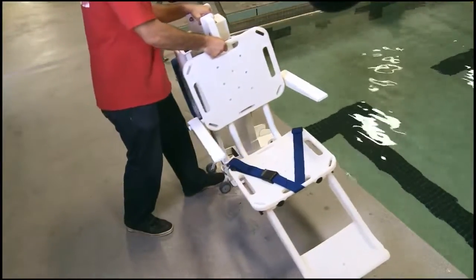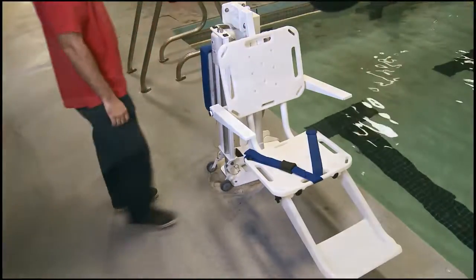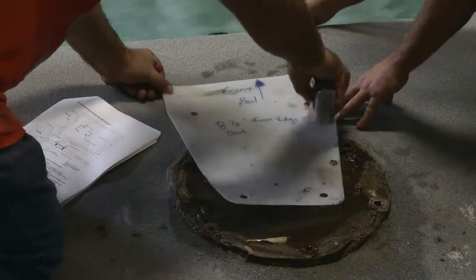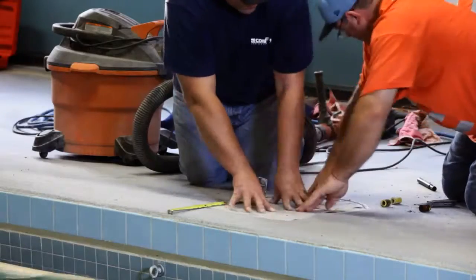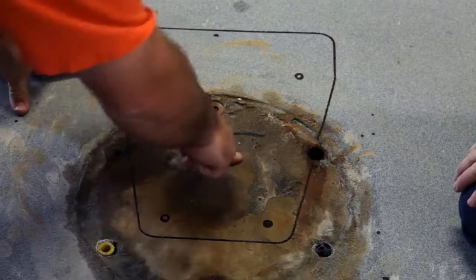A multi-lift is being installed to replace a non-ADA compliant pool lift. The installer inspects the site to ensure it meets the ADA deck space and water depth requirements. Using the multi-lift anchor jig, he marks where he will drill the holes in the deck.